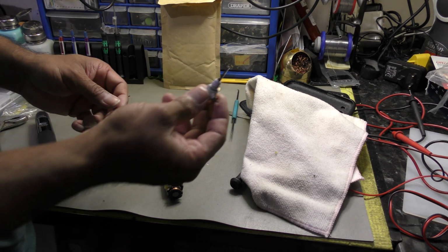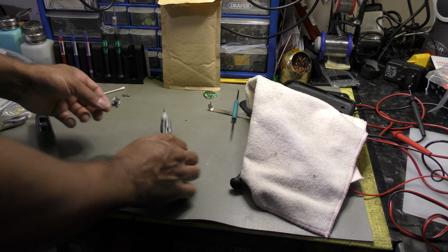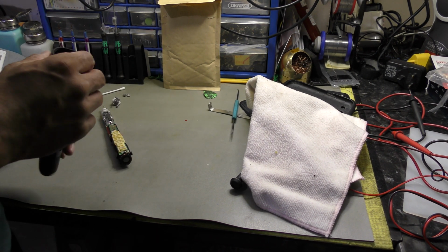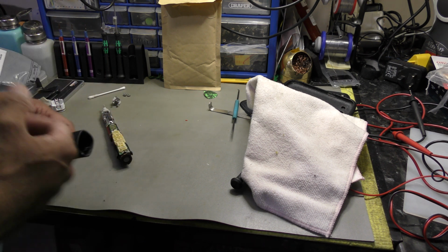So what I've done is I've bought one off eBay for $9.99. This is the actual old unit. I've already put the unit back on. First thing first is, how did I take this out? Okay, it's pretty simple and straightforward. I've seen people pressing with clamps and all this and that. You don't necessarily need to do that.